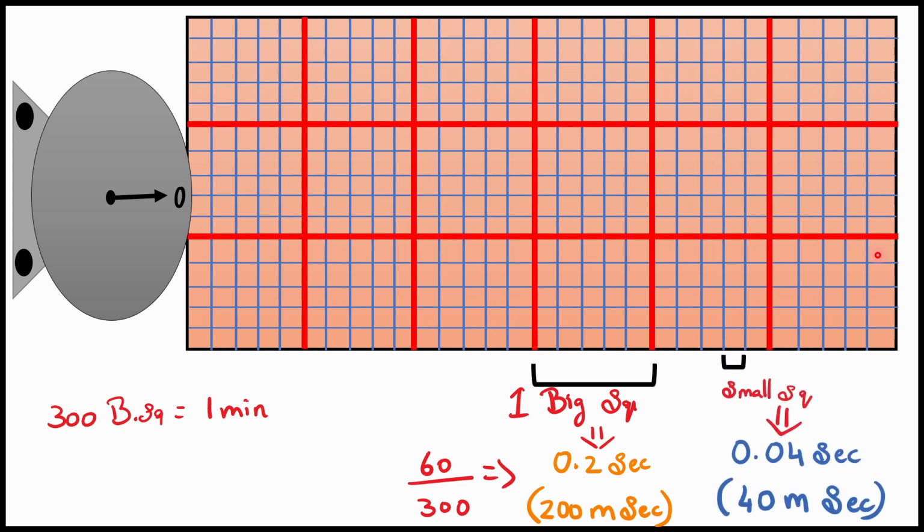From our previous discussion, we know the duration of the waves. So the P wave is 80 to 120 milliseconds, which means nearly 3 small squares. I hope you are getting my words. 1 small square equals 40 milliseconds. So 120 by 40 is equal to 3. Then QRS complex is around 80 to 100 milliseconds, which means around 2.5 small squares. And we know QT interval is 440 milliseconds. So around 10 to 11 small squares, which is 2 big squares.